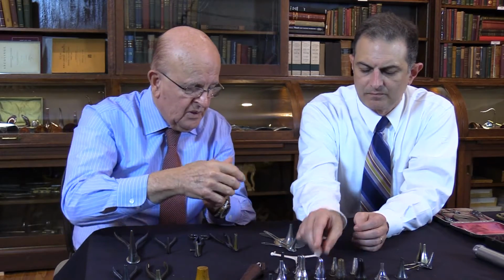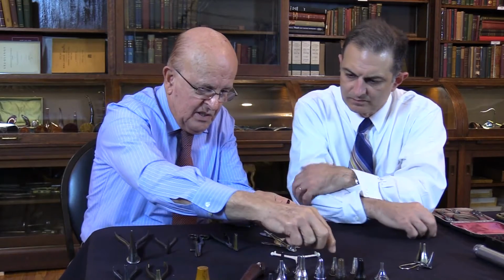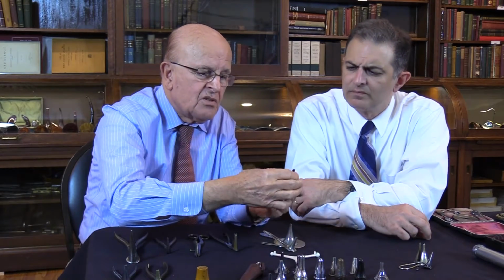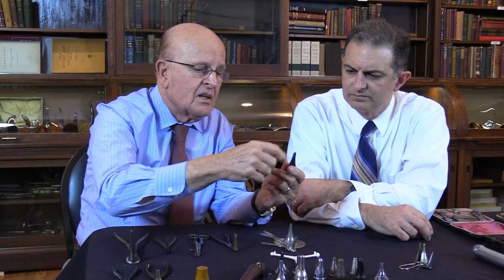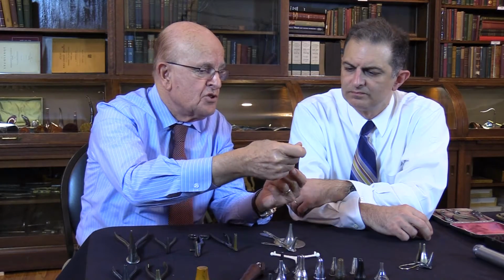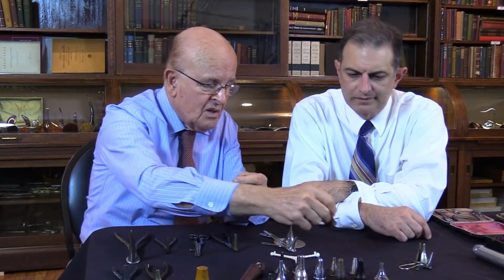Well, as you can see, when talking about the ear canal and the narrow, look at this here with the slant of the tip of it. And I think this here is just to push against the anterior hump. Yeah, and it looks very similar to what we use in the operating room today.